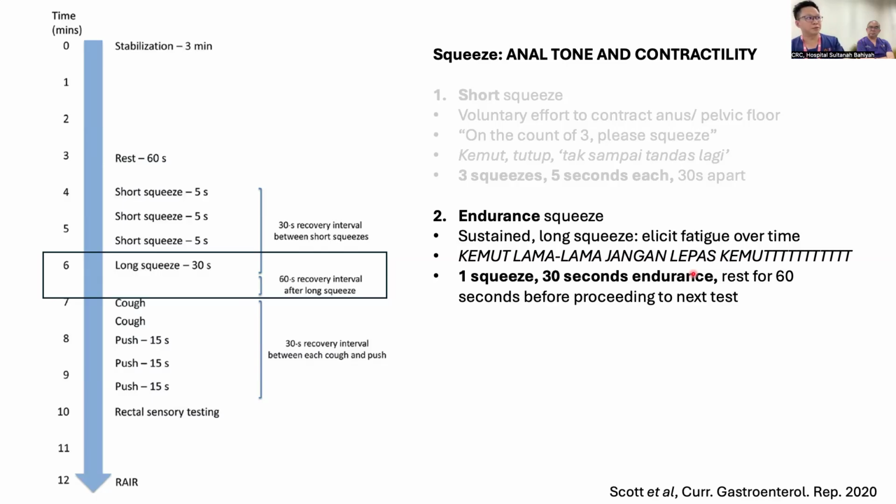Whereas when it comes to the balloon expulsion test, we are actually assessing the manner of them passing out the fecal material. It is a simulated actual defecation, an overall function. Yes, maybe one small component may be impaired. Maybe 2 out of 10 components may be impaired. But what is the overall impression? Can they still pass the balloon out? That is an overall impression.